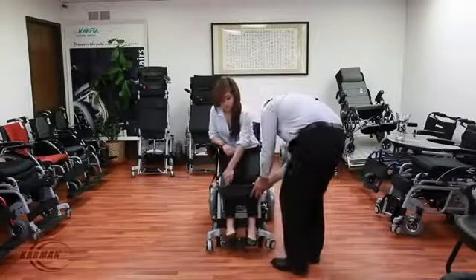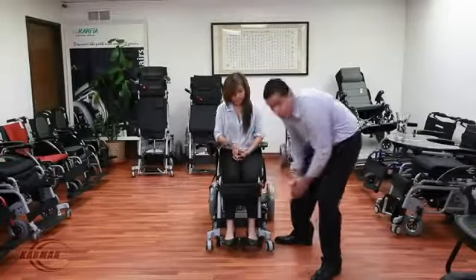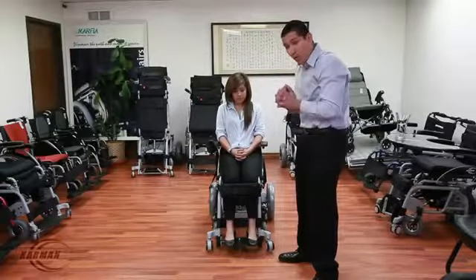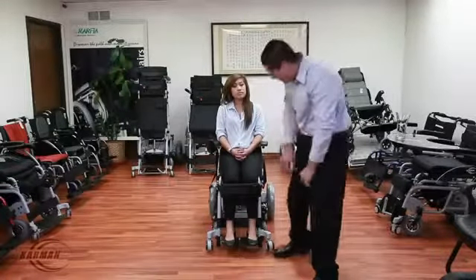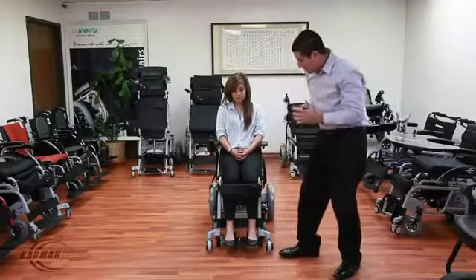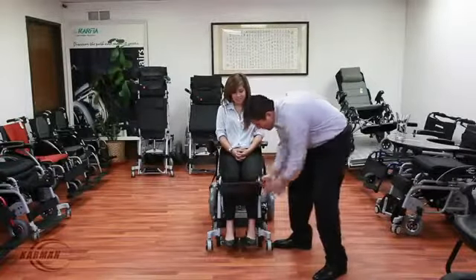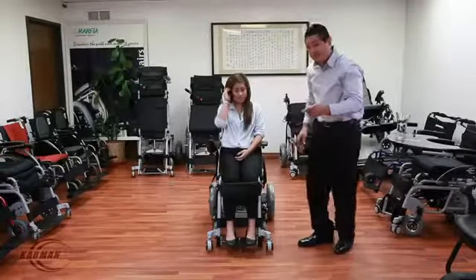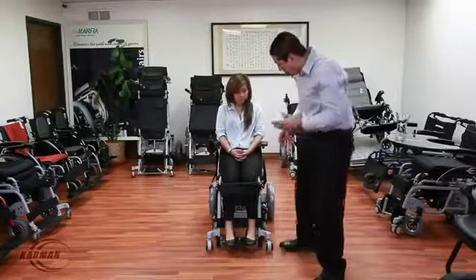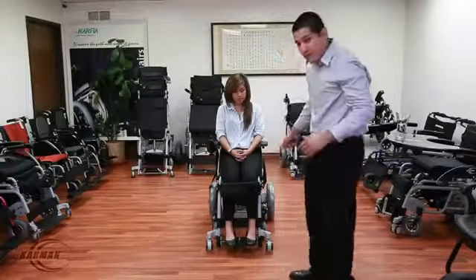First here folks, this is the knee wedge. This knee strap, as you see here, supports the legs and makes sure the legs are nice and secure and strong. This strap is adjustable, very easy with Velcro — you're able to adjust the tension, adjust how tight. How does that feel, Janice? Good, perfect. She's nice and secure. You're also able to adjust it to a higher hook — some people need more compression on the upper part of the knee, and that's what that second hook is for.